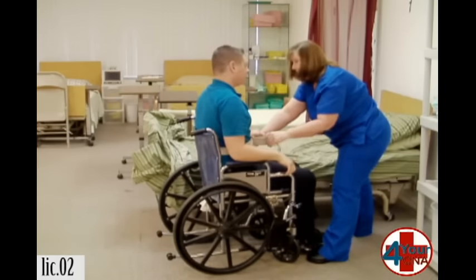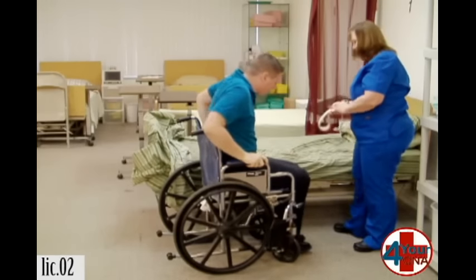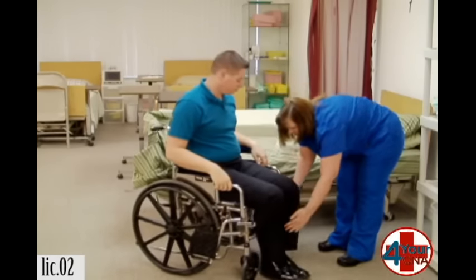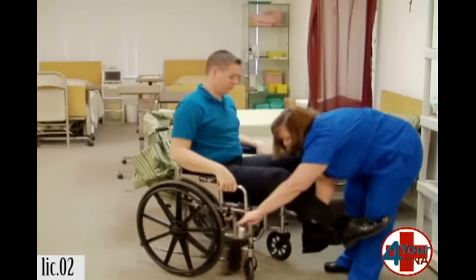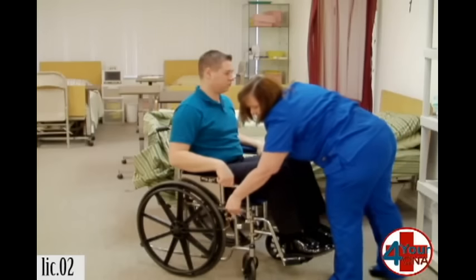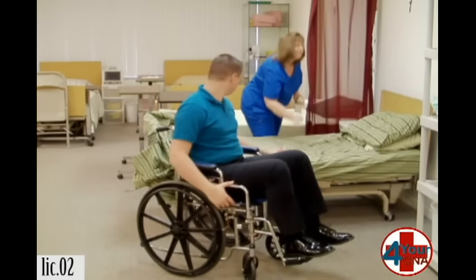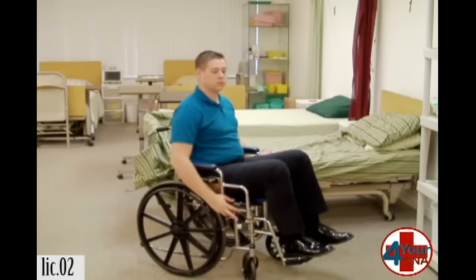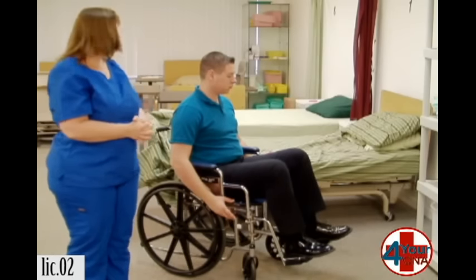Very good. You feel okay? Yes. Okay. We just removed the gait belt from you. I'm going to unlock your wheelchair and turn you around so that we can position your leg on the foot pedal. There you go. Let's relock your wheelchair. Feel free to unlock the wheelchair if you'd like to move. You feel okay? Yes. Here's your call light if you should need anything. Now I'm going to wash my hands. I'll review the steps of my skill, make any corrections, and my skill is done.